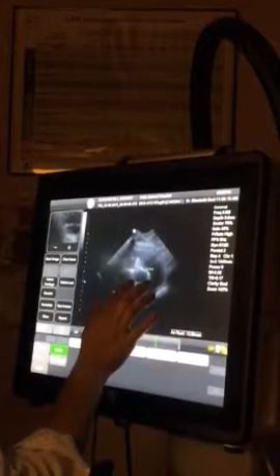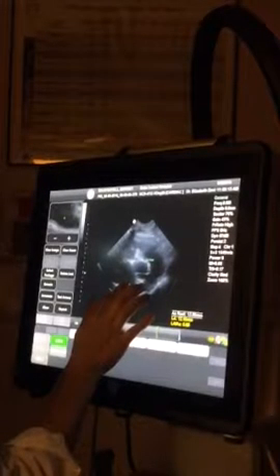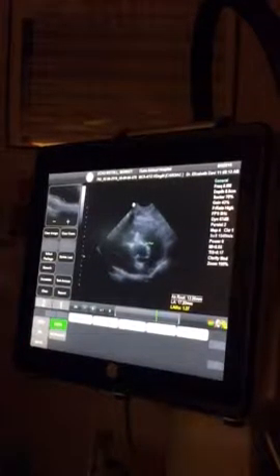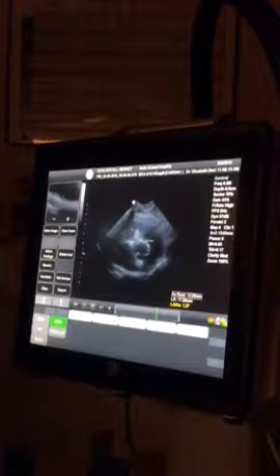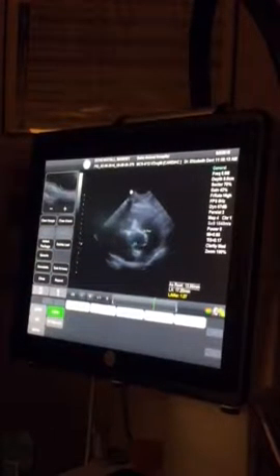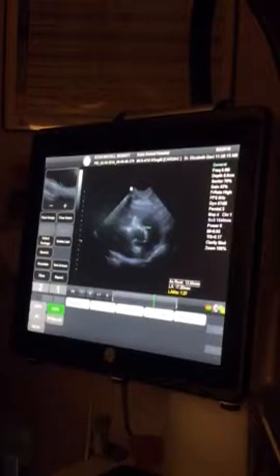Now you'll just touch and drag down to the wall. Sometimes the calipers may not meet if the wall looks a little bit different. Use your judgment in that area. There are certain scenarios where you may have to make some lateral adjustments with your calipers when you have such a pseudo-thick area. But here we're pretty good with that area.